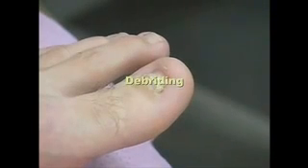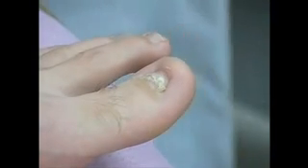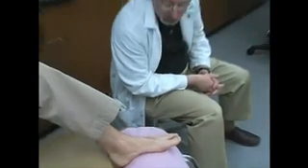This is a good example of a partial nail plate spicule that's left. And the good thing is there's enough of a plate there for us to bond to. So I'm going to try to build out a new plate with a KeryFlex, and we'll go through the steps. It will require a little debridement because the nail's a little flaky.